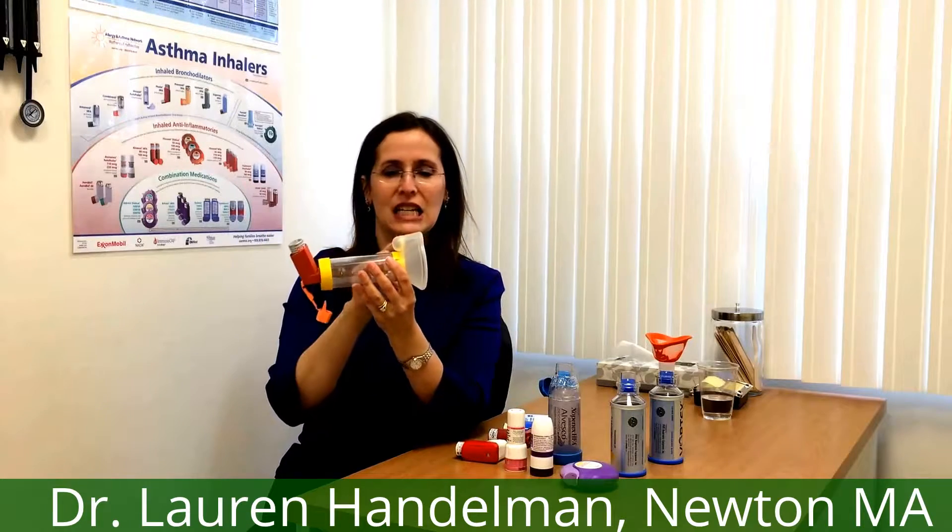When you give an inhaler to a child who can't really coordinate a puff, inhale, and hold their breath for ten seconds — especially a three or four year old, or an infant — what you need to do is put the inhaler mask right on their face. When you put this over their mouth and nose, it needs to cover both and get a fairly good seal. You don't have to push it really hard; it just needs to seal against their face. When you puff down, they need to just breathe normally, but you have to watch them for six breaths.